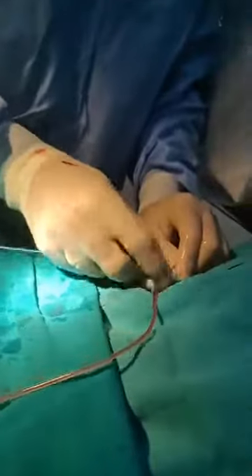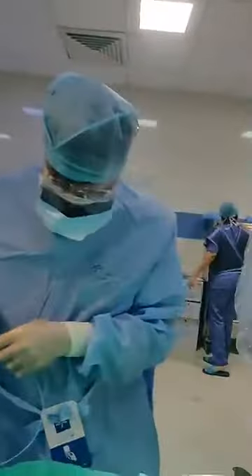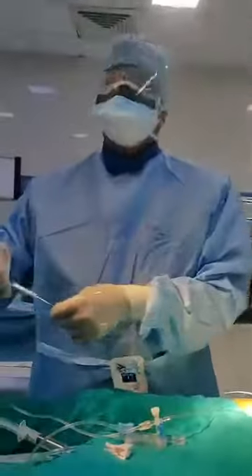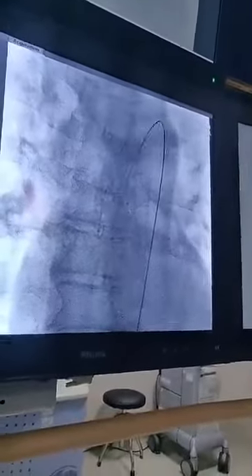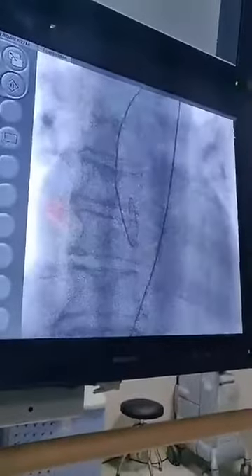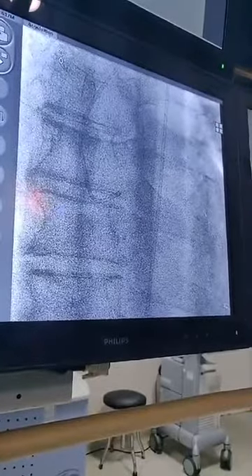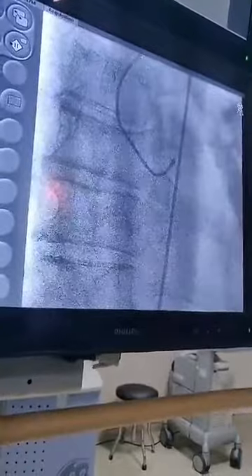Overall the procedure of angiography is simple. It is done under local anesthesia, and you can see how we introduce the catheter — we introduce it here via the femoral artery. Now you can see the catheter is going inside the coronary artery, through the aorta. Now the catheter is in the aorta and we are inside the coronary artery.